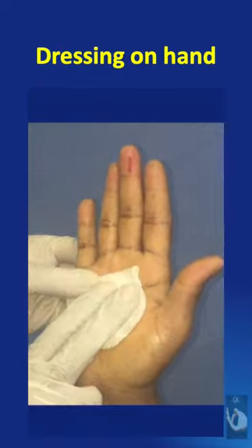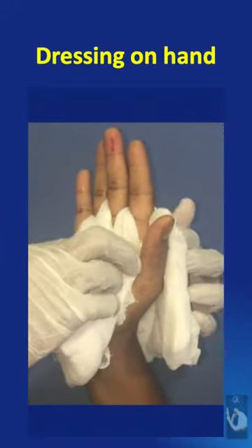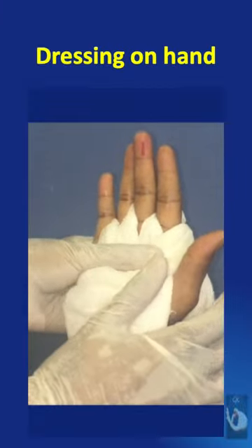Next, a piece of absorbent gauze is placed and then gauze pieces are placed in the finger web spaces. A gamgee pad is applied in such a way that it goes around the hand and within the thumb web, thus separating the thumb.